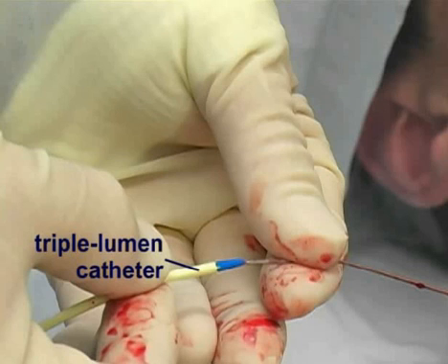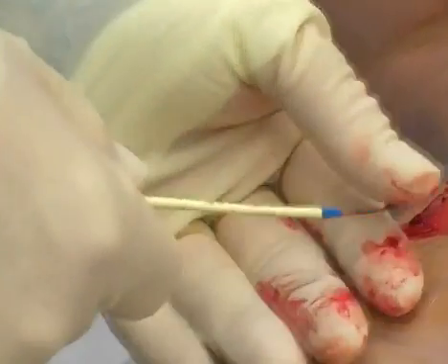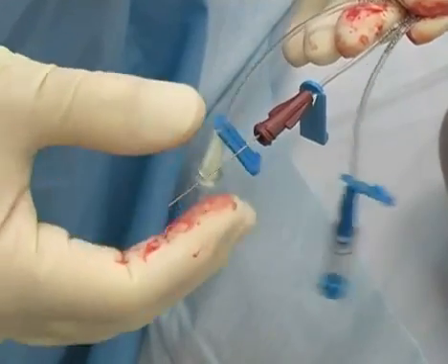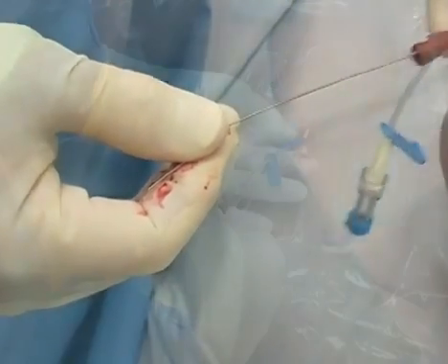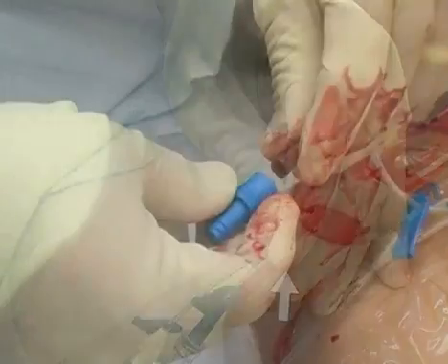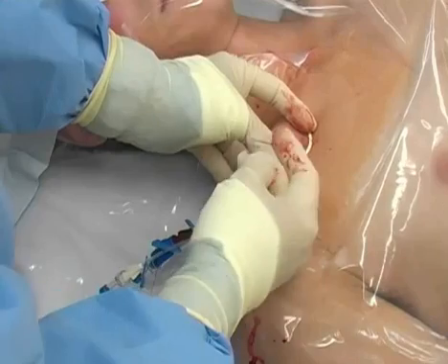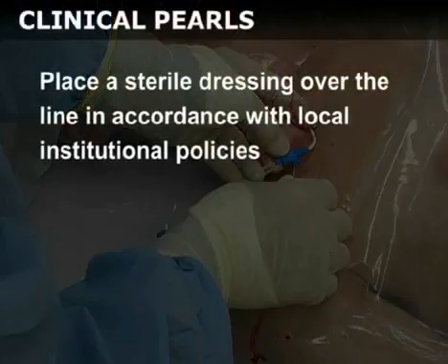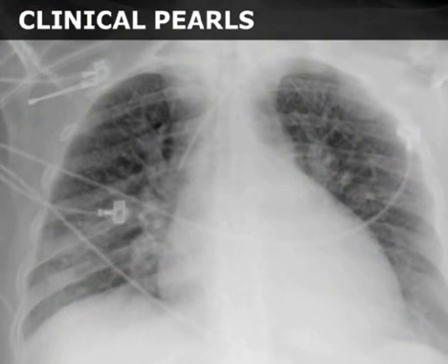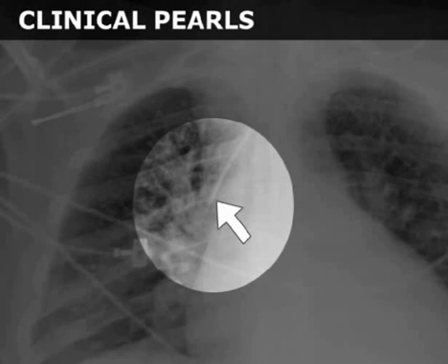Next, advance the triple lumen catheter over the guide wire. You must grasp the wire from the distal end hub before fully advancing the catheter into the vessel. Once the catheter has been placed, remove the guide wire and immediately cover the hub with your finger. Finally, place an end cap onto the open hub and flush all of the ports with saline. Secure the line in place with a stitch and place a sterile dressing over the line in accordance with local institutional policies. A chest radiograph should be obtained after all subclavian line insertions to assess for proper positioning of the catheter tip in the superior vena cava and to evaluate for iatrogenic pneumothorax.